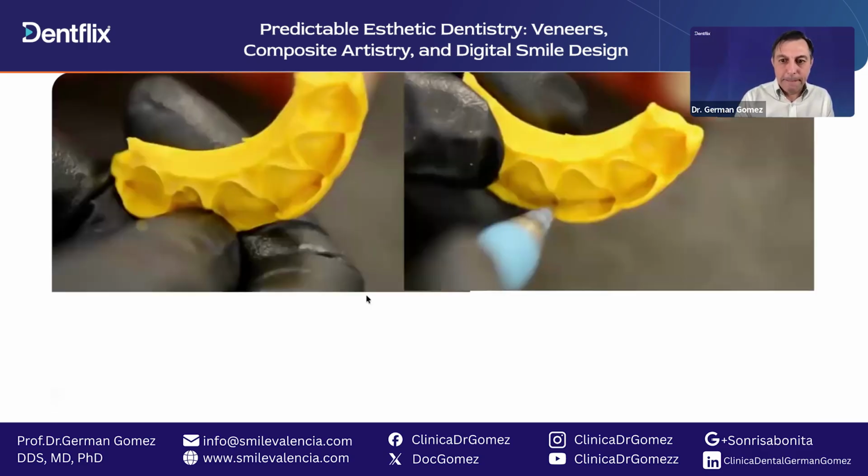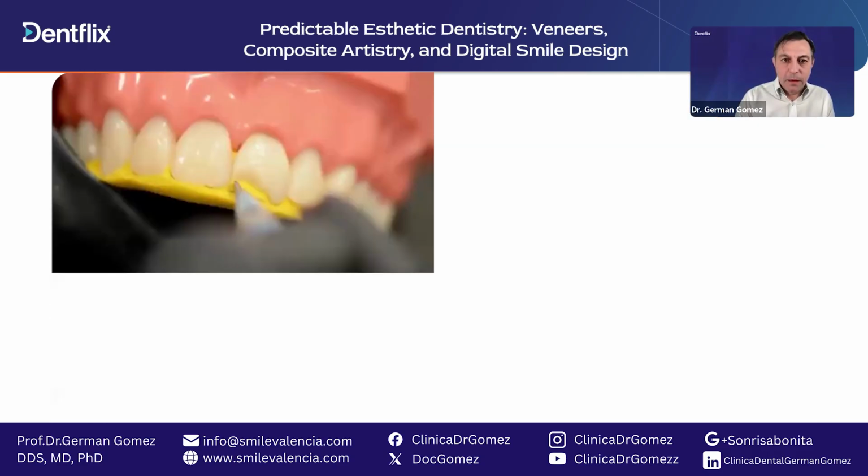Now we have the neighbor tooth here, and then we just paint on the putty where we want to have the incisal edge, following exactly the edge of the neighbor tooth.